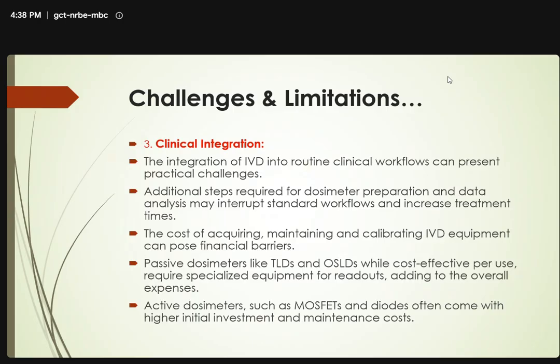The cost, of course, of acquiring, maintaining, and calibrating in vivo dosimetry equipment can pose financial barriers. Passive dosimeters like TLDs and OSLDs, while cost effective per use, require specialized equipment for readout, adding to the overall expenses.